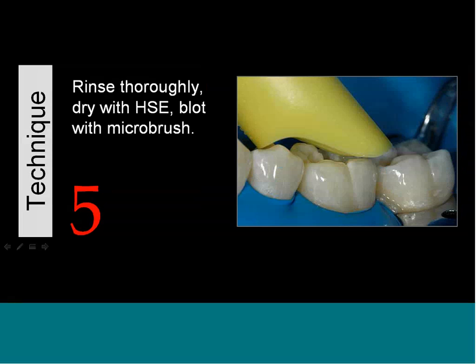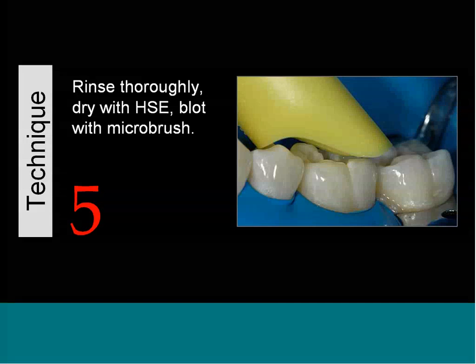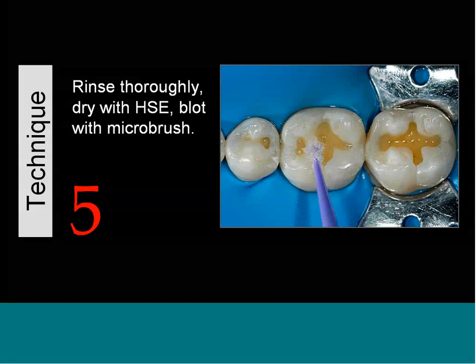So here's a little tip for the clinicians. One of the best ways to make sure you have the right amount of wetness, or water, or dampness, whatever you want to call it, for total etch, is simply to take the high-speed evac, have your assistant put it over the preparations, and suction for just a quick second, getting out as much water as she can, and not blow these dry or air dry them or over dry them, because that's one of the causes of sensitivity: not having these preparations have the proper amount of moisture. If you have excess water left, you can blot it out with a microbrush, cotton pellets, foam pellets, whatever you like.